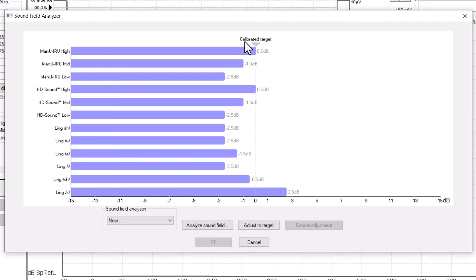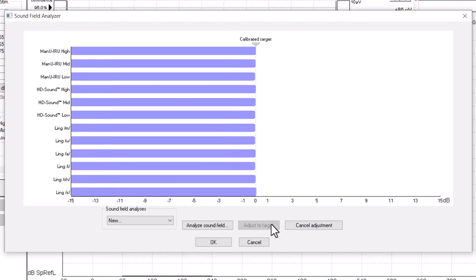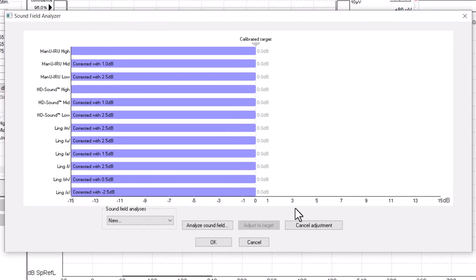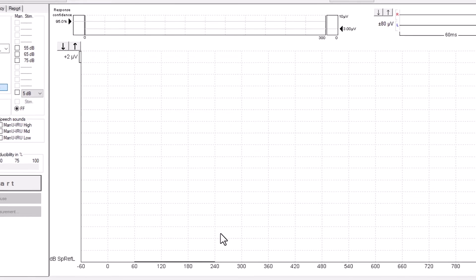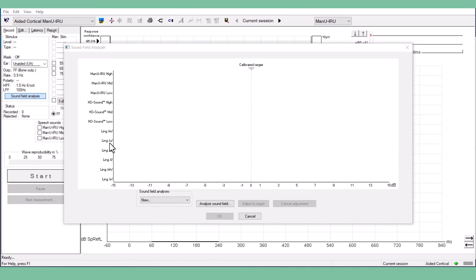If the results do not match the calibrated target, as seen here, you can press Adjust to Target. This will adjust the stimuli to match the calibrated levels. Press OK to save your Soundfield Analysis. The adjusted value is also shown on the test result report.